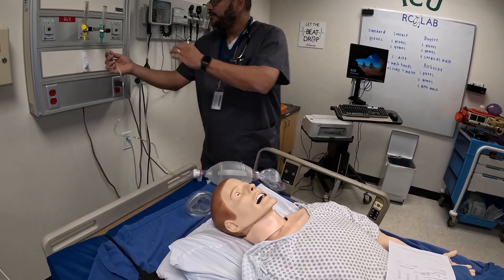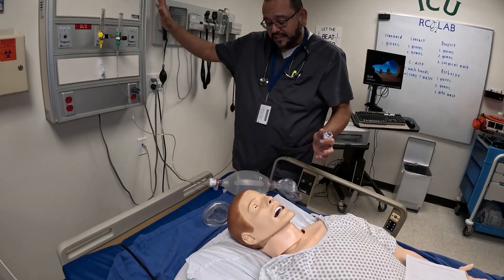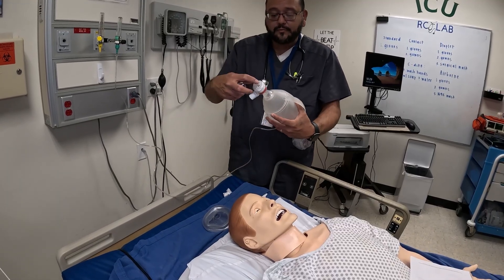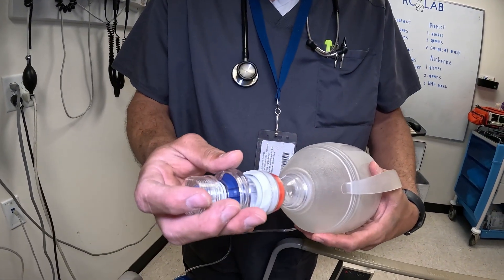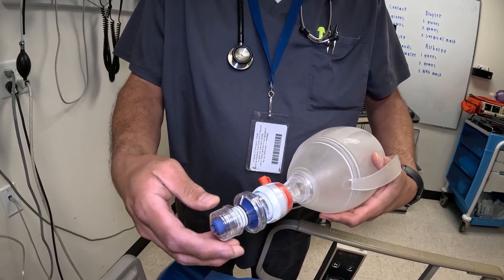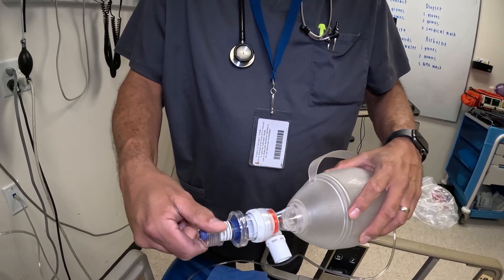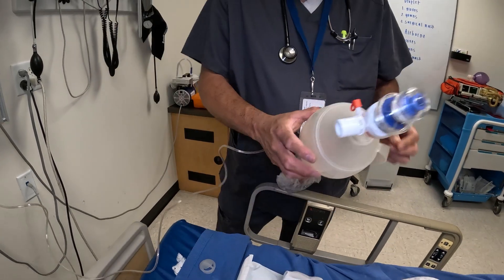We're not turning on the compressor for noise level, but you would turn it to 15 liters or flush. If you're going to use a PEEP valve — and I do recommend it — you may need to remove a part first. On this particular one, remove this piece and place the PEEP valve on. Turn it to set your PEEP: right there would be 10; further out would be 5; you can increase it to whatever level of PEEP you want to place the patient on.